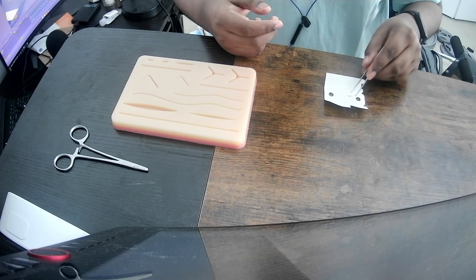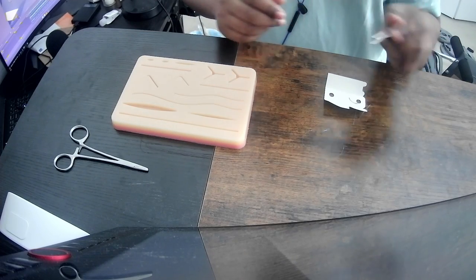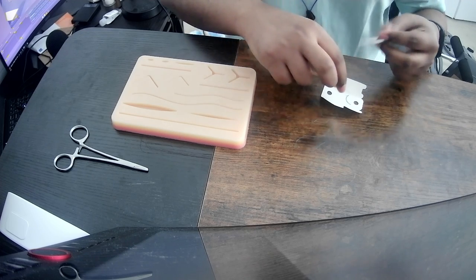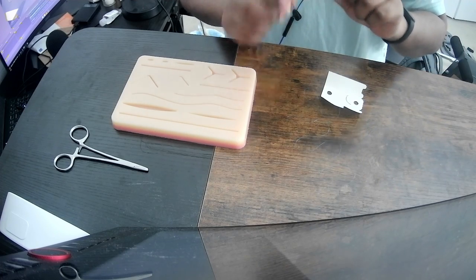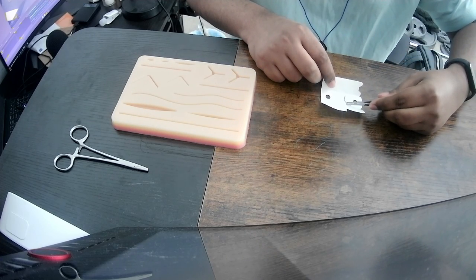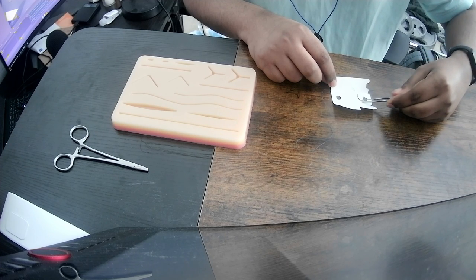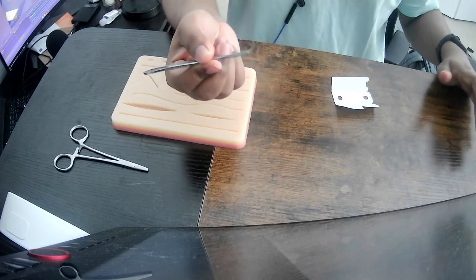Now, again, you really want to be mindful. Let me try that again. That's pretty good. I thought it'd be much harder, but okay. So yeah, I'm using my left hand, my non-dominant hand, to grip. Oh, I guess I really do have to be mindful of which direction the teeth are. So the two pronged side is facing away from me. And let me see if I can. No. Okay. Switching hands. Not too bad.